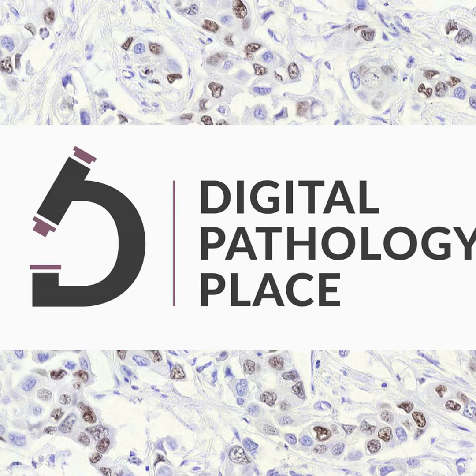If we intend to use DICOM for diagnostics, which we do, then we have to develop or reevaluate AI algorithms on this format. But that's not surprising, that you have to reevaluate or train on different formats. And I think the message here is it's not identical.